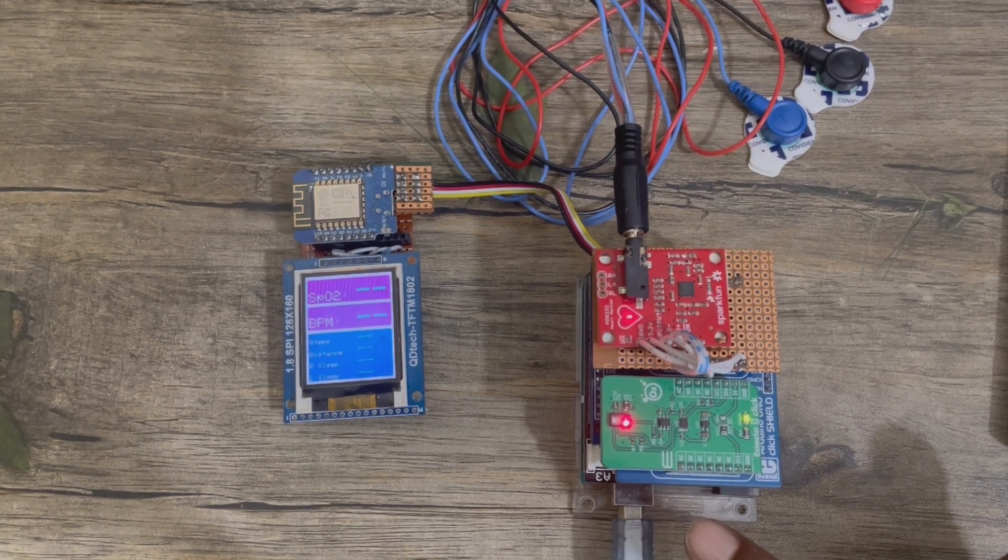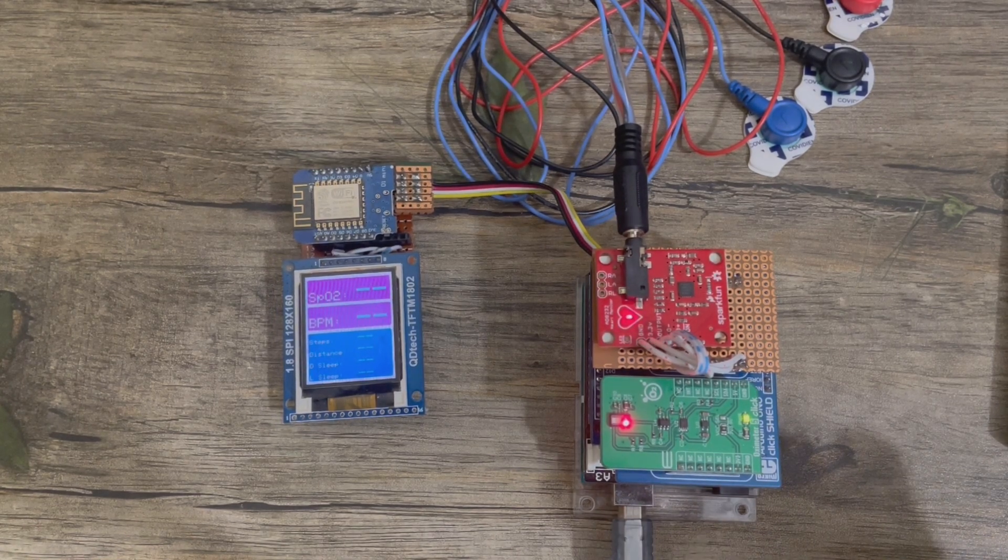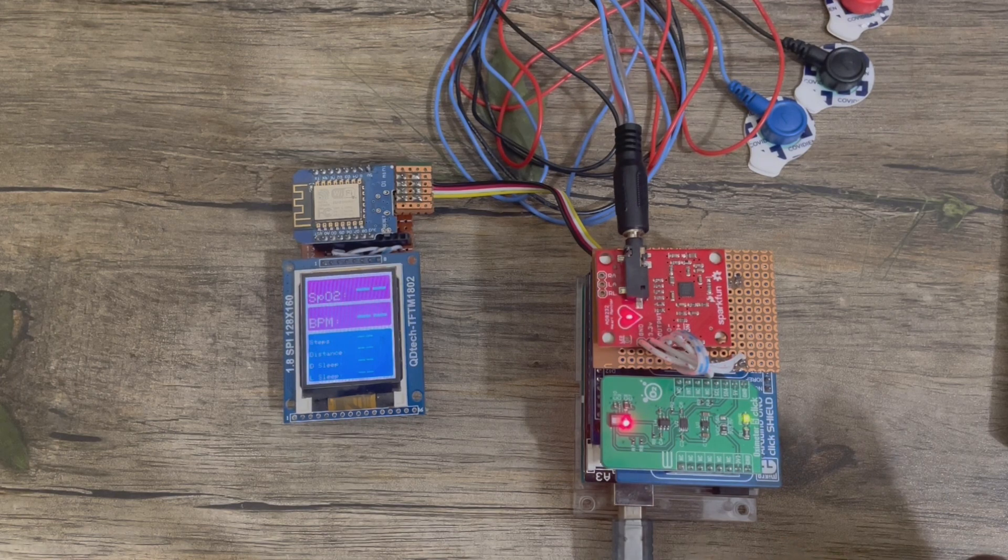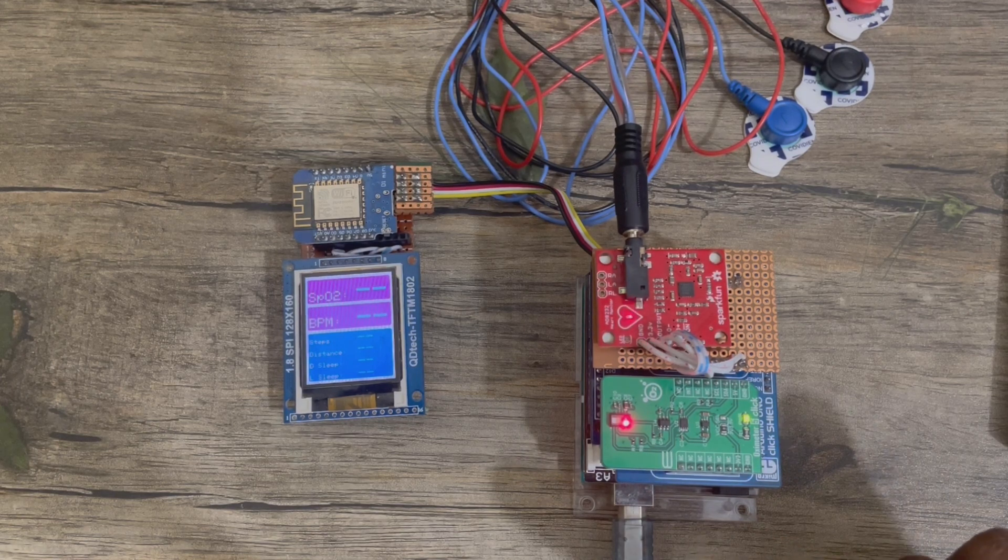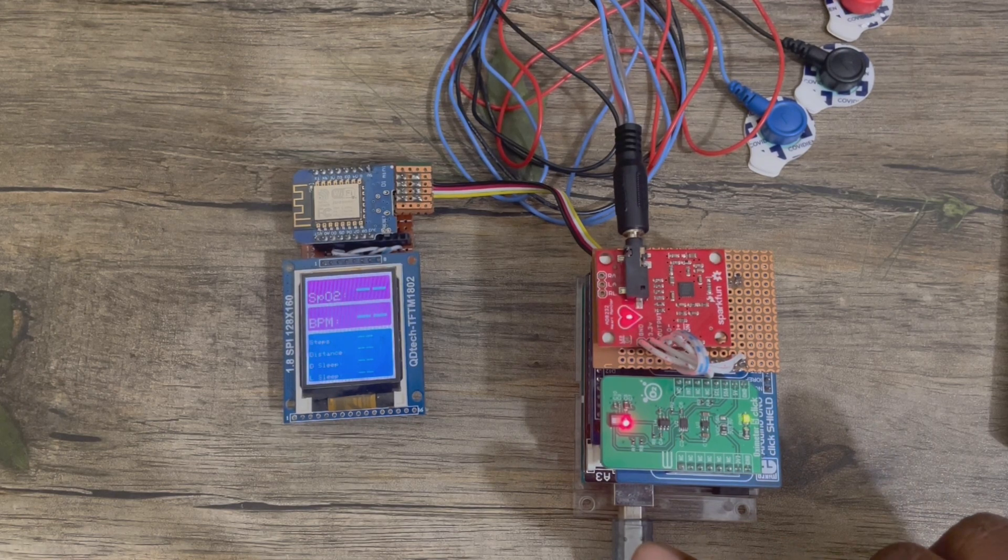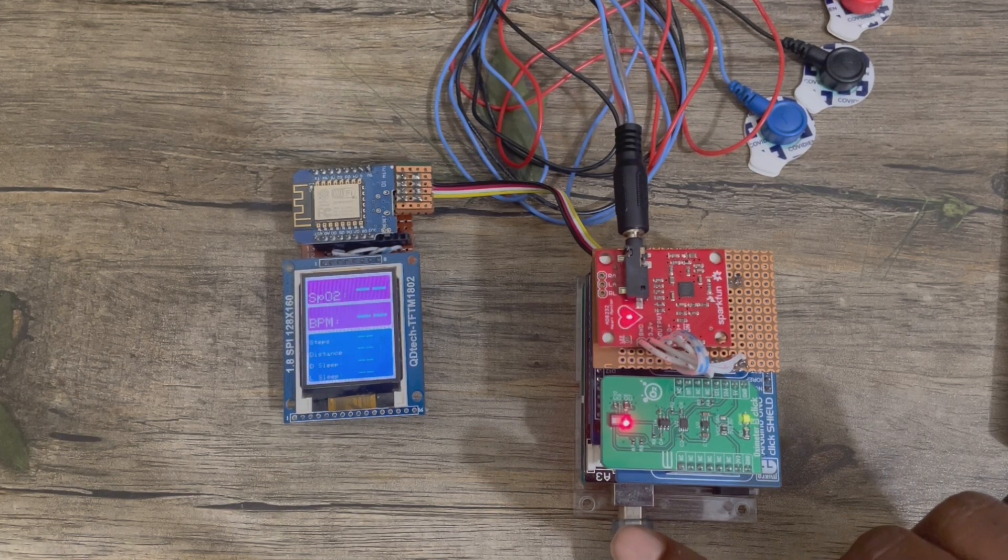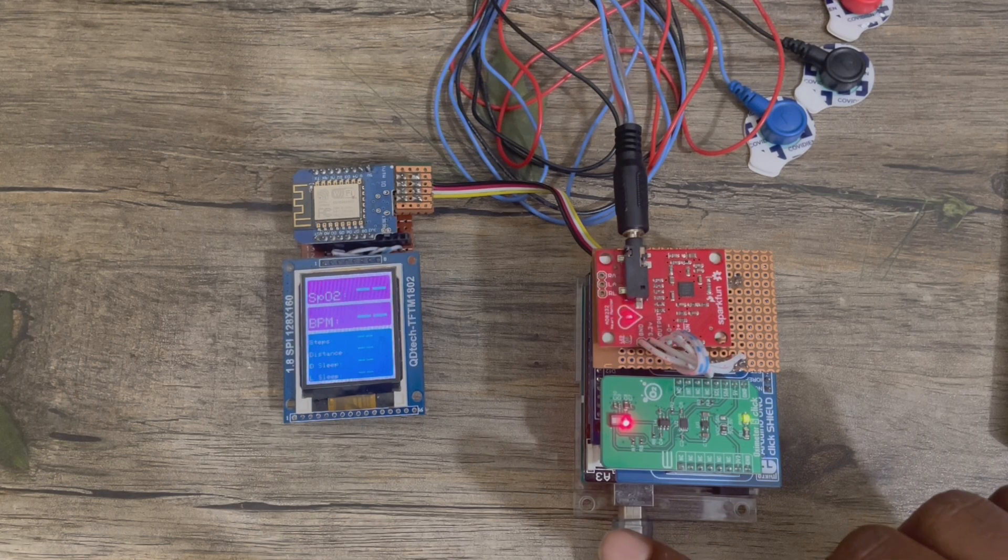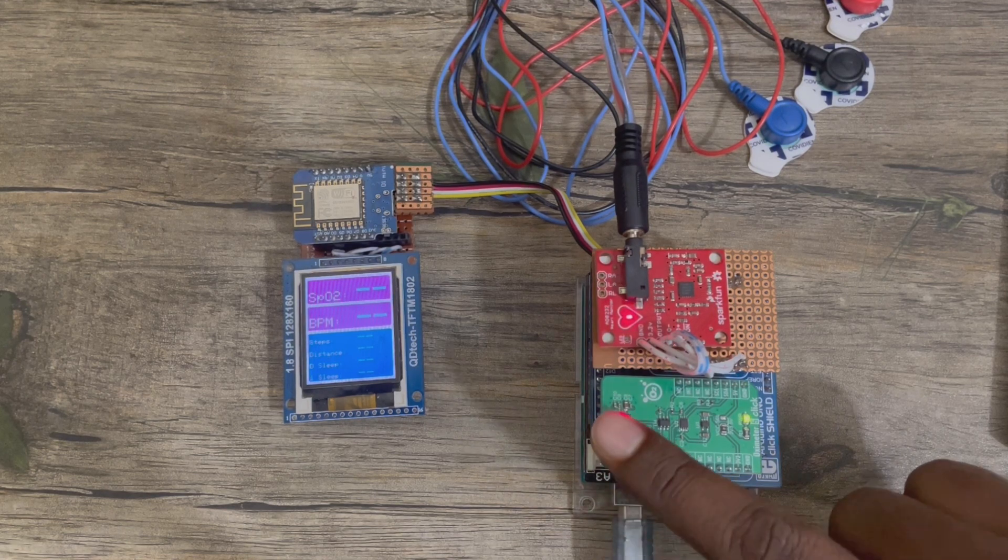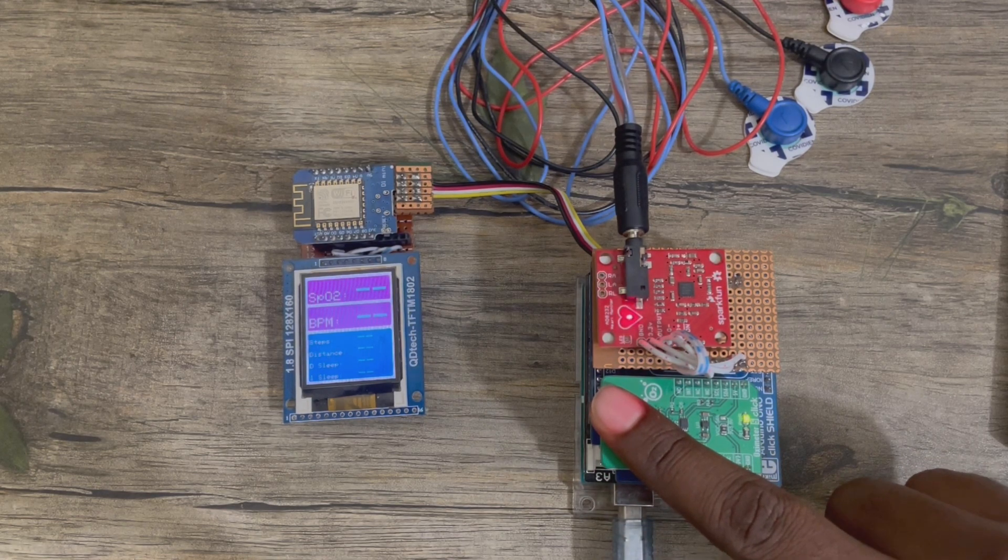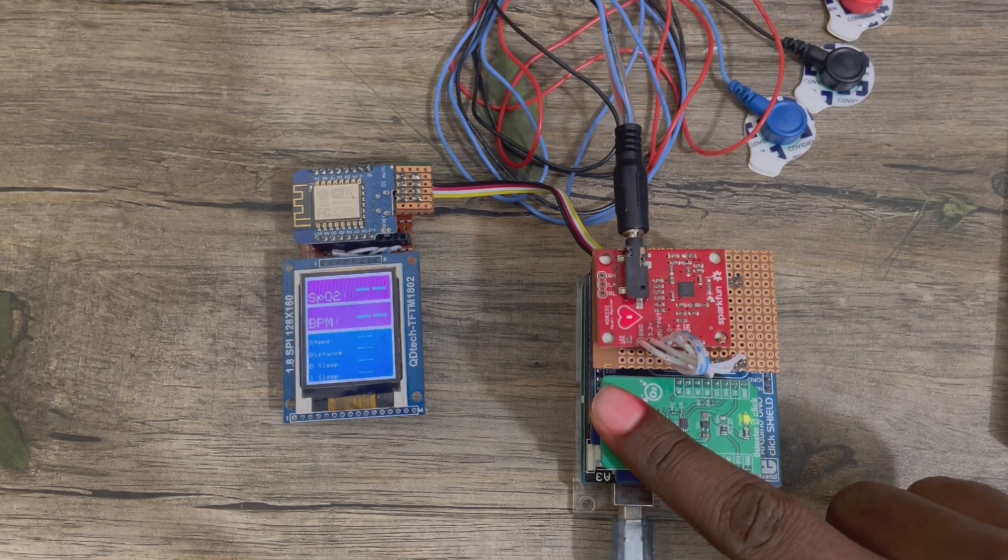Both units are connected now. As currently there is no finger here, SpO2 and BPM data is zero, and ECG leads are not connected. Let's press my finger.